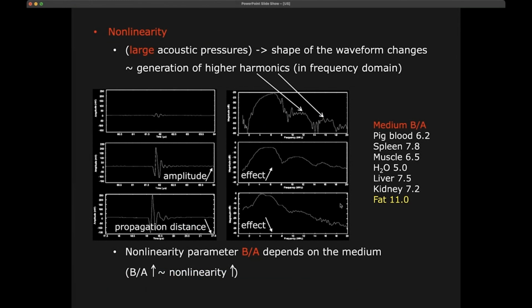So then we can use this, of course. Here you see another one. This is, in this case, a measured one, where you can see that the larger the amplitudes you get, the more you will go into this higher frequency. So that is what I'm saying.